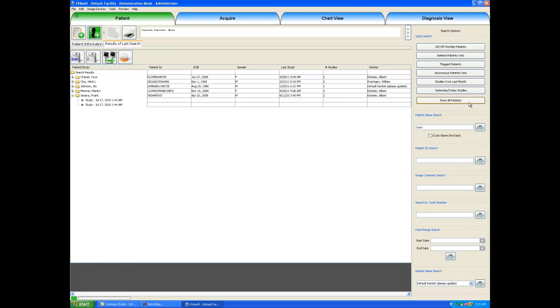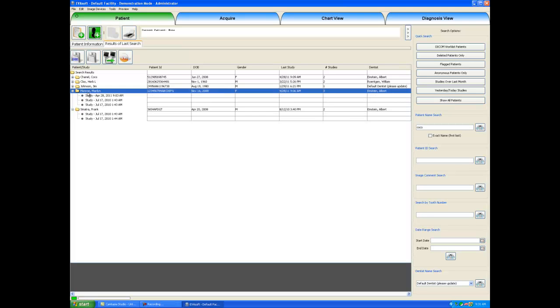Again, I will click show all patients, and it will show us every patient in our database. Now in the main window, if I double click on a patient's name, for example, Marilyn Monroe, it will show us every study, every chart that we have taken on Marilyn Monroe.